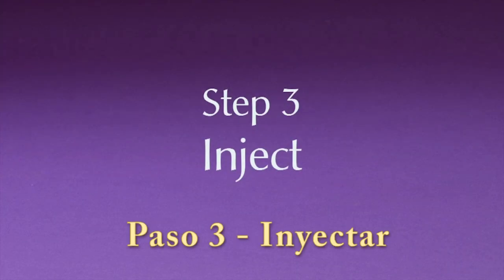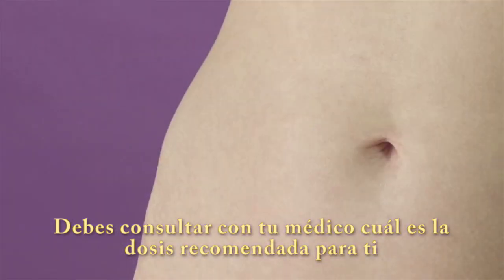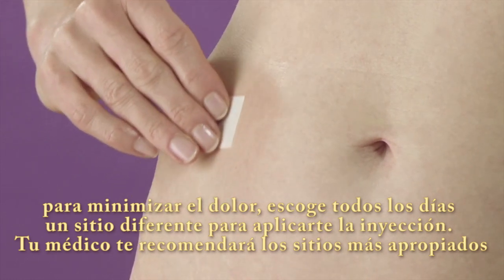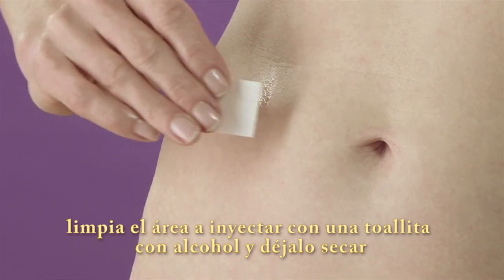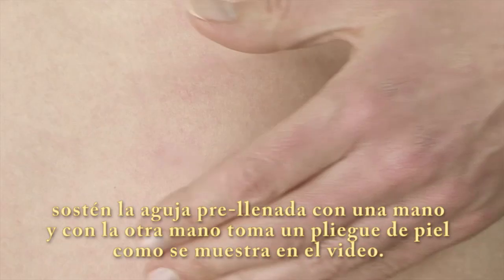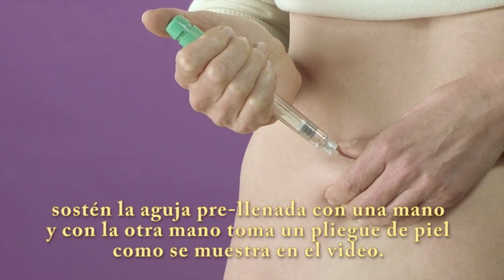Step 3. Inject. Your healthcare provider will have discussed suitable injection sites with you. To minimise discomfort, it is best to select a different injection site each day. Clean the recommended injection site with an alcohol swab and let it air dry. Then, hold the pen with one hand and with your other hand, pinch the skin around the injection site as instructed by your healthcare provider.